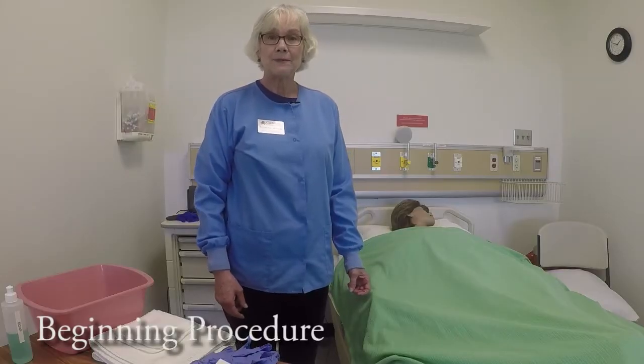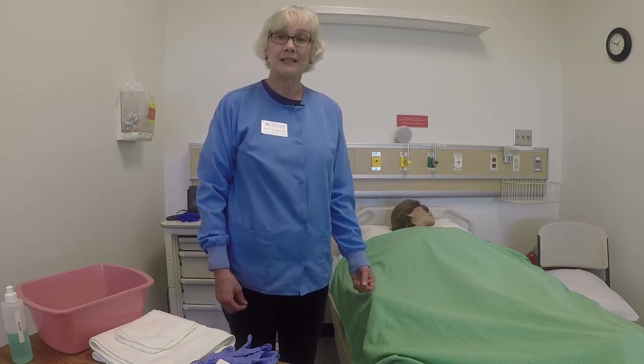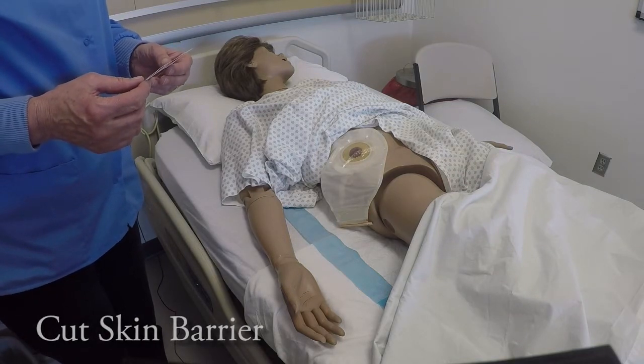B is for the beginning procedure, which includes things like providing for safety and infection control, identifying the patient, and getting their permission by explaining what you're going to do.